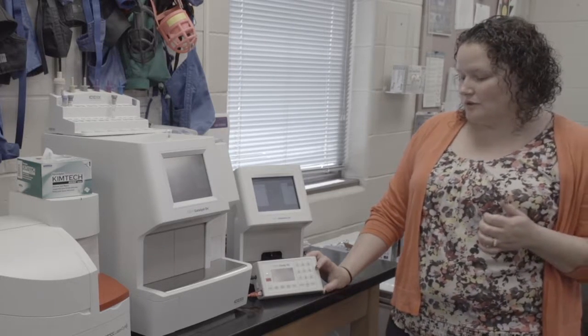You run those cartridges, you use a blue top sodium citrate tube, and it's super important that that tube is 3.2% sodium citrate. Any concentration higher than that and your tests are never going to clot. You're going to constantly get high results. So any tubes you get from us will be the 3.2%, but if you order from another offsite company, they could be higher, so just make sure you check that.